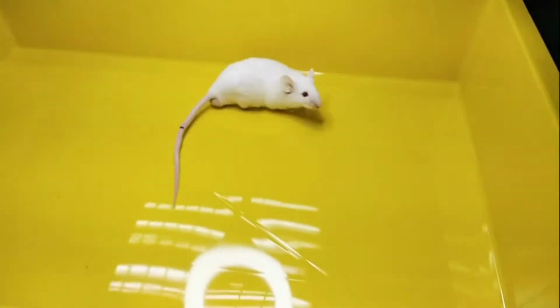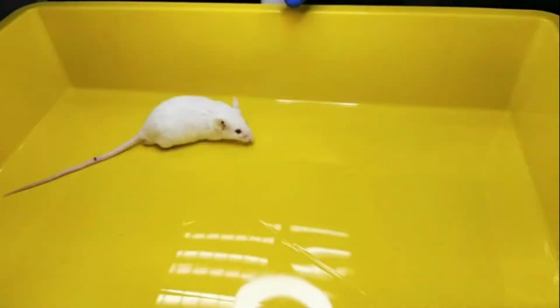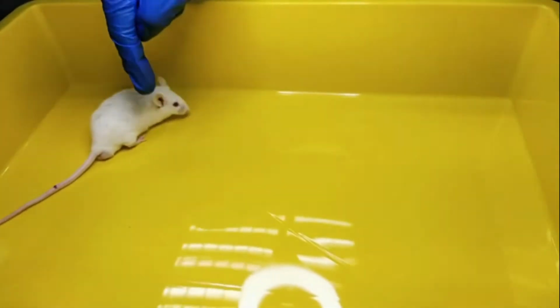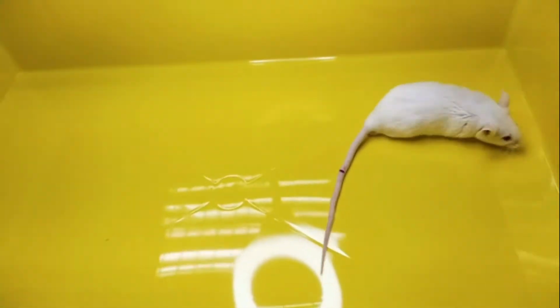So after a few minutes of injection, as you can see here, this one for mouse number 1 is already showing the sign of loss of reflex. As you can see from the way the mouse is walking, it's not balanced anymore. If you push the mouse like this, it's having a hard time to walk, as you can see over there. So this is the sign of the animal losing their reflex. Okay, it's not able to walk properly, and the way it walks is off balance. So from this moment you need to record the current time when the animal is losing their reflex.